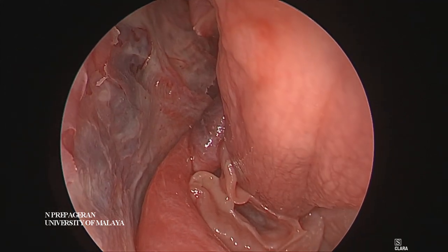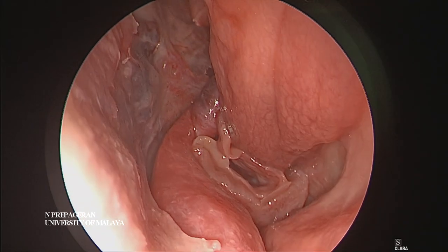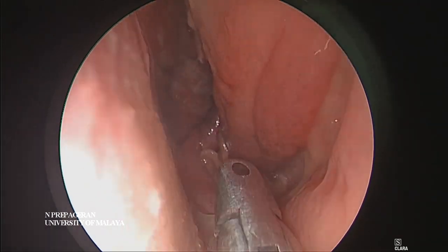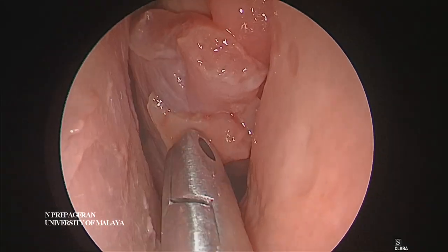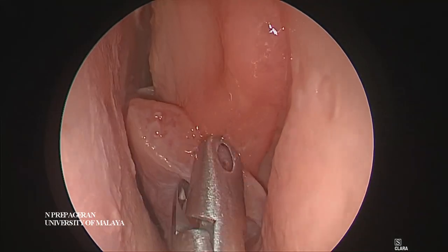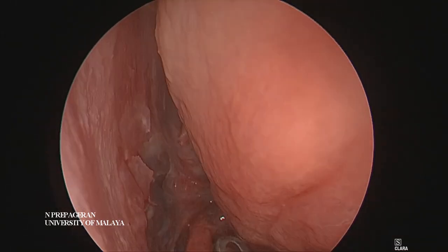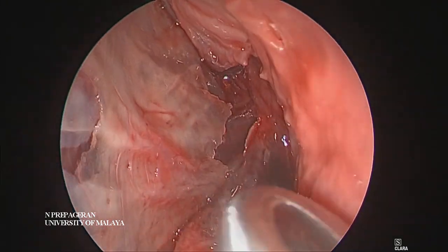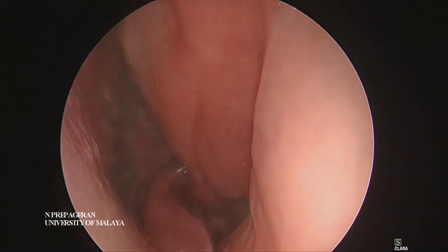Let me place this for a while - you can see how large the flap is. You can actually push and hold the flap there. It's a nice large vascularized Hadad flap, a pedicle septal flap. We're going to push this into the nasopharynx. That's the sphenoid ostia there and you can see how the flap comes exactly from the posterior nasal artery, just beneath the sphenoid sinus.